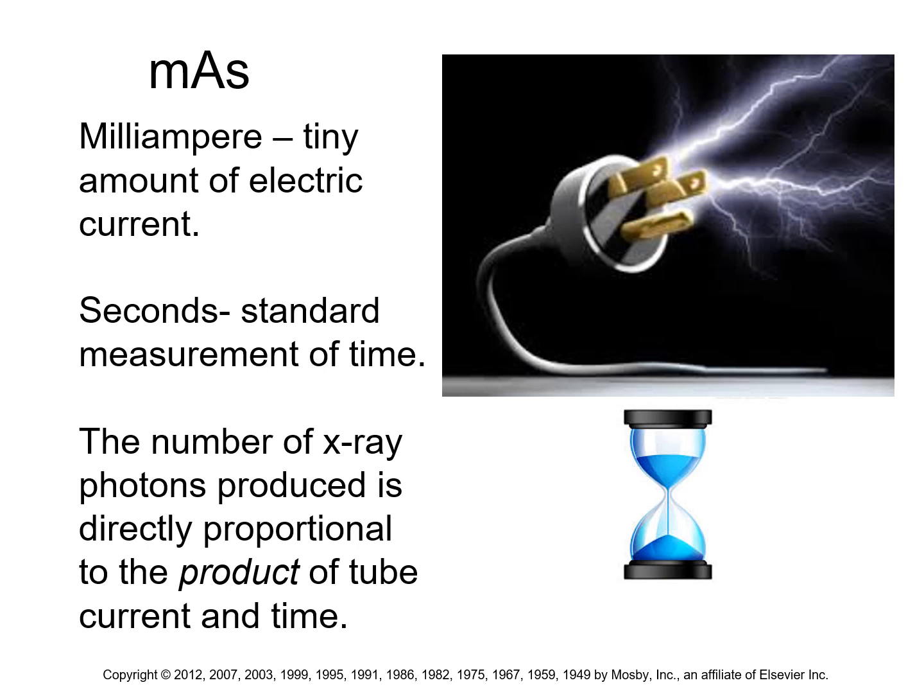Now, the other component of mAs I mentioned already is exposure time. Okay, seconds are the standard measurement of time. Okay, seconds, minutes, hours, those kind of seconds. Now, typically when we're talking about X-ray exposures, we're talking about tenths and hundredths of seconds because we don't want motion on our X-ray. So the product of these two, X-ray tube current as milliamperage times exposure time, that is directly proportional to the number of photons that we're creating in the beam.